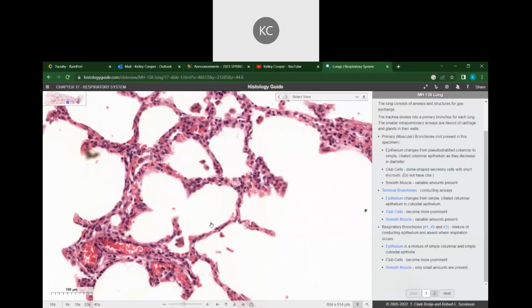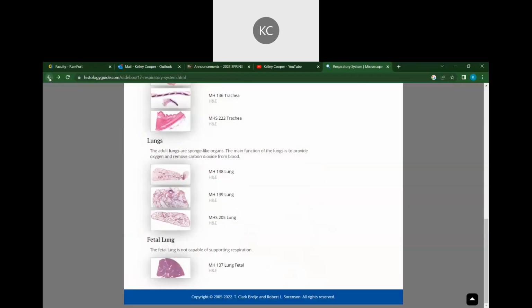And so this process of gas exchange requires a very thin membrane in order for the gas to diffuse across this barrier. So we've got to go from the inside, so this white region here, across this membrane into the blood, right? Well, one way to accomplish this is to have a very thin membrane that allows the gas to diffuse very easily across. If you had a very thick membrane, this would make the diffusion much more difficult, all right?